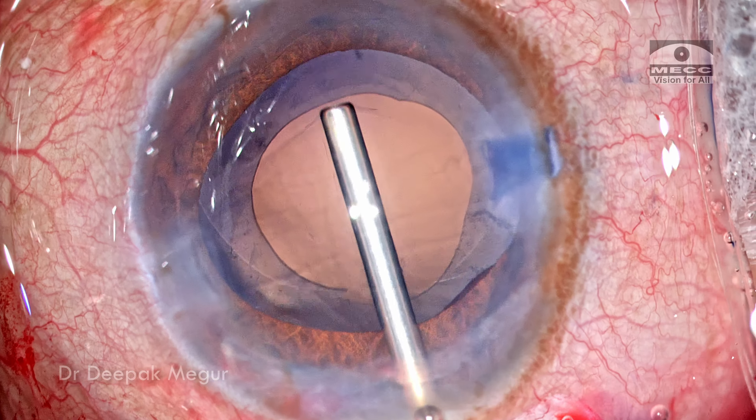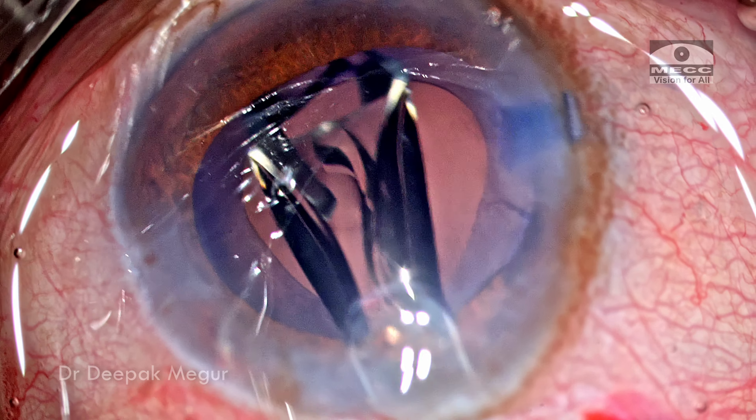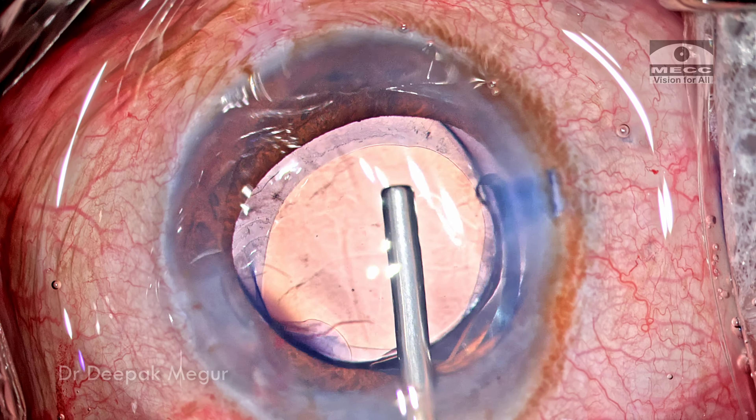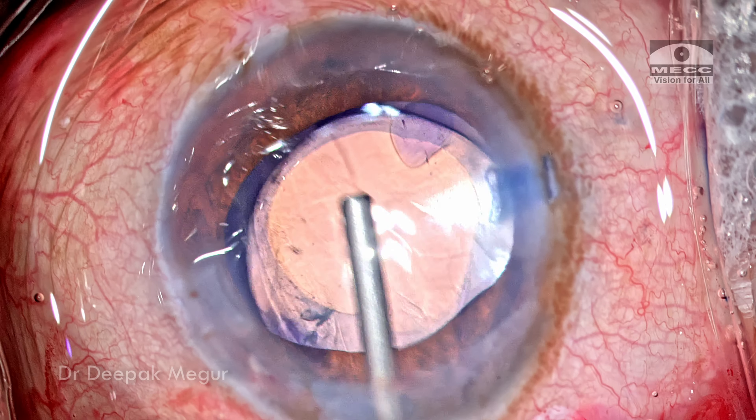OVD is placed into the capsular bag and a foldable single-piece hydrophobic IOL is implanted into the capsular bag. The trailing haptic is nudged in — it looks all right. Now is the time to remove the OVD.